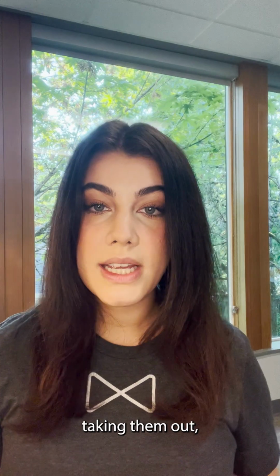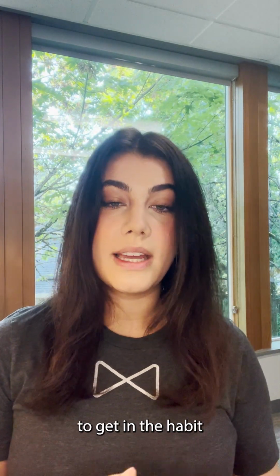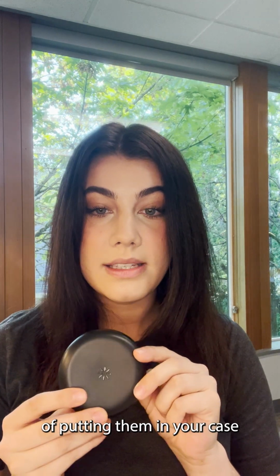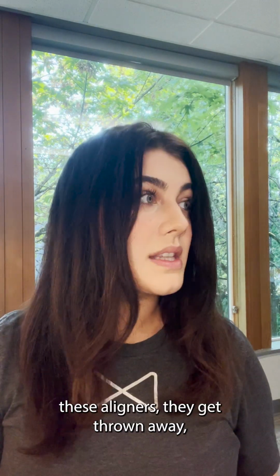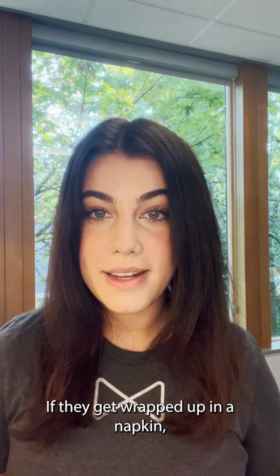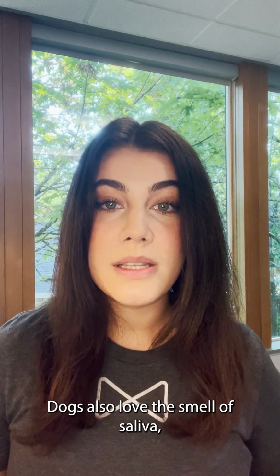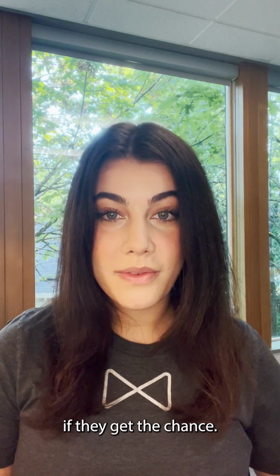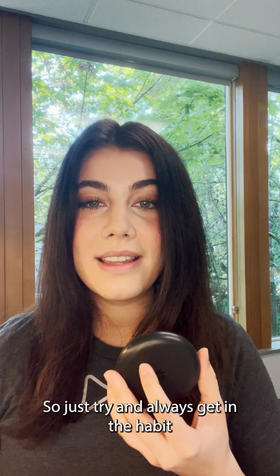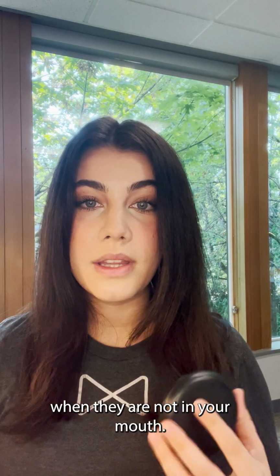So then whenever you're taking them out, whenever your aligners are outside of your mouth, it's really important to get in the habit of putting them in your case. Just because a lot of times these aligners, they get thrown away, they get broken. If they get wrapped up in a napkin, someone will throw them away. Dogs also love the smell of saliva, so they will chew them up if they get the chance. So just try and always get in the habit of having your case on you and putting your aligners in here when they are not in your mouth.